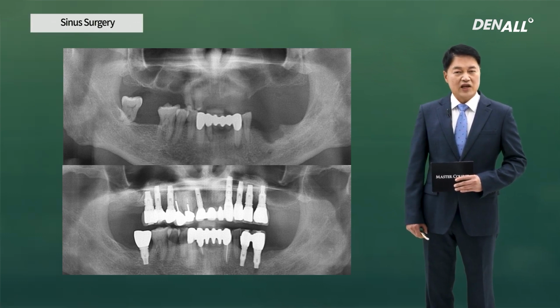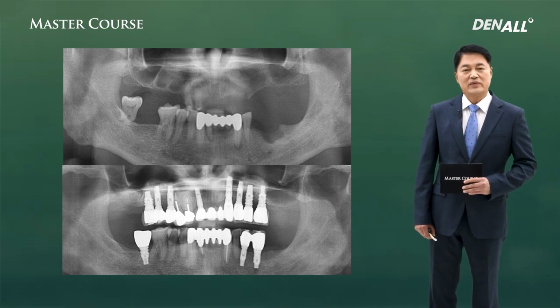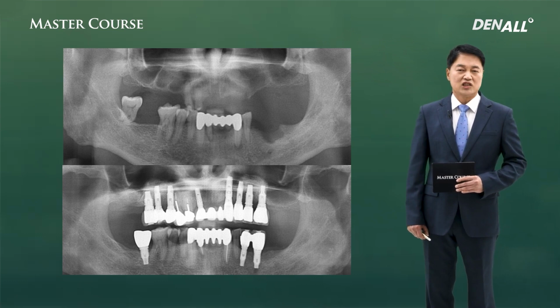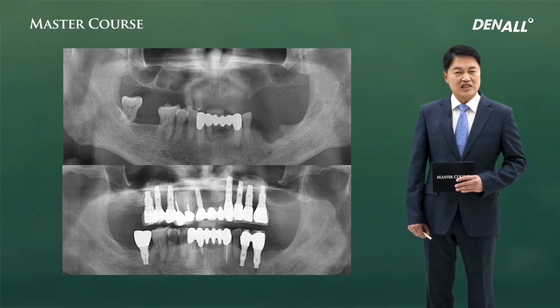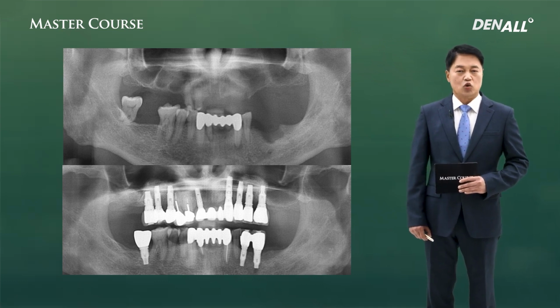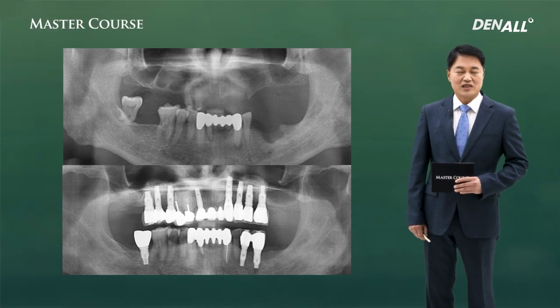for people who place implants a lot, sinus is an area of blessing. No matter how severe bone resorption has occurred, even if there is very little bone, you can make bone easily in the sinus. However, if you treat the sinus carelessly or if there's inflammation, you would not be able to make bone and you have to invest a lot of time and energy in rebuilding it. What we need to do to make this area an area of blessing, we need to understand the sinus surgery and approach it very cautiously.